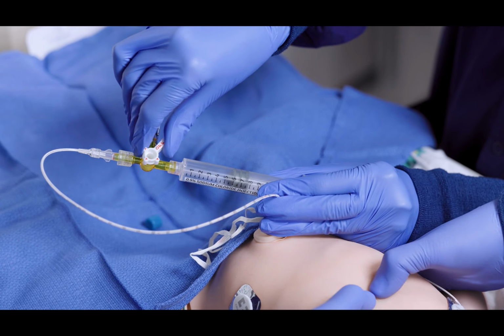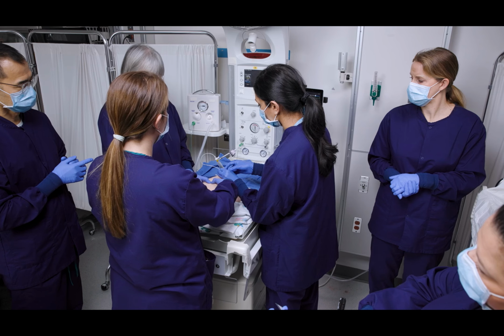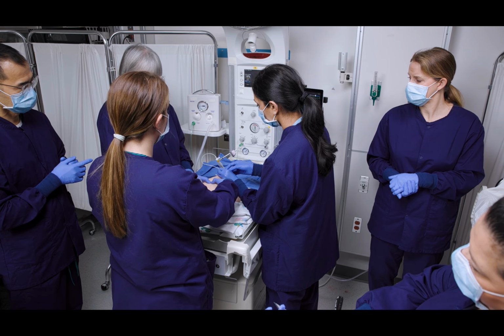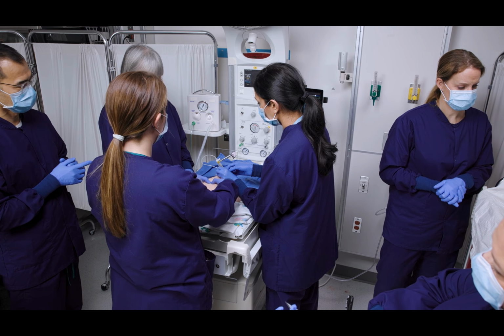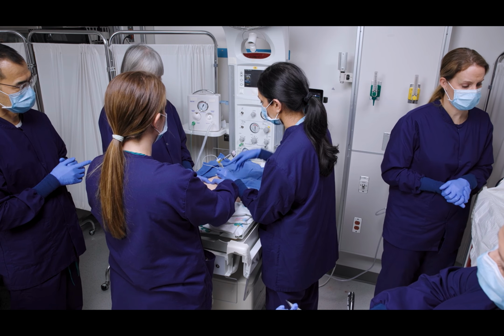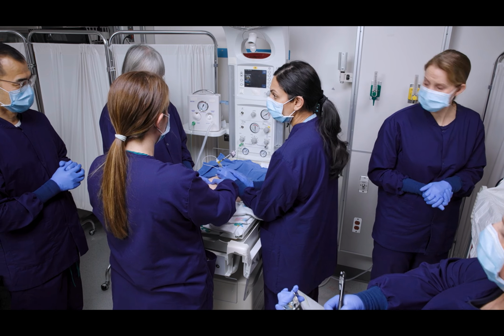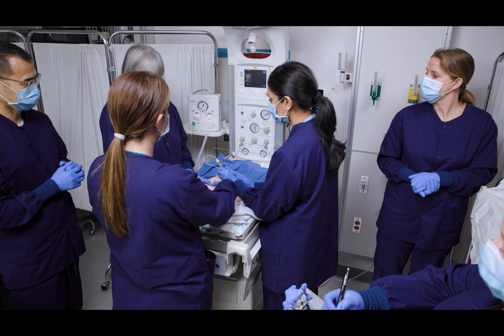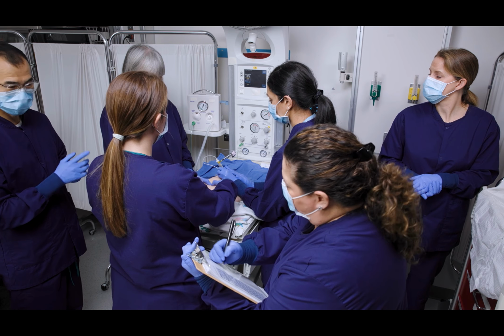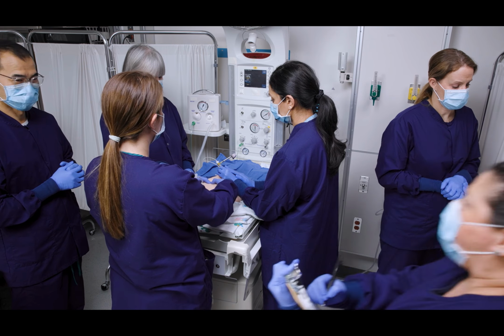Now, turn the stopcock so that it's open between the baby and the normal saline flush. Gently flush the epinephrine through the catheter with 3 mLs normal saline. Turn the stopcock off to the baby. Intravenous epinephrine given. Now the recorder can acknowledge the intervention, document the time, and alert the team when 1 minute has passed to check the heart rate.